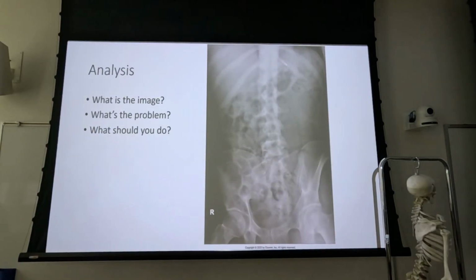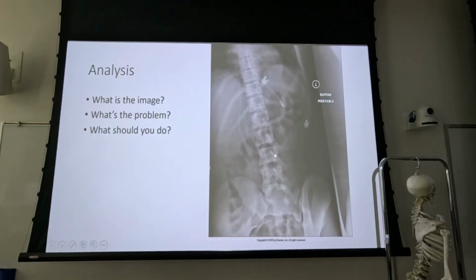What do we have here? Rotation. There's a right marker there, so the patient's rotated towards their right side, exactly. So we've got some rotation there. Starting to get some pretty decent Scotty dogs. So, yeah. So I'm not even going to ask on this one. This is just everything wrong with this one. You got a KU, no B.